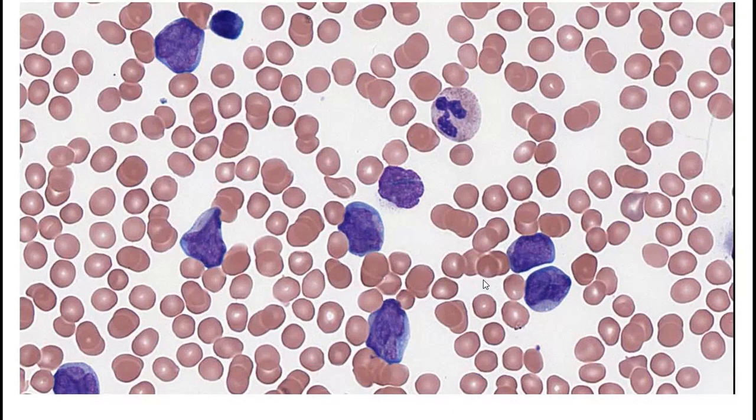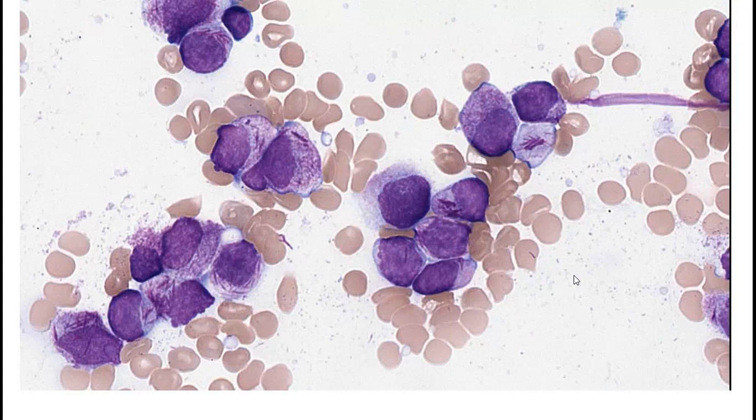The second slide I want to show you is definitely a leukemia because these cells are very early, and some of you have picked up this is a promyelocytic leukemia. This is a single Auer rod right here. The specific feature is the folded nucleus, and this is APL. This is another APL with a different feature. This one in the bone marrow, you can see beautiful Auer rods, even this fragmented cytoplasm that has shattered off. There are lots of bundles of Auer rods everywhere.